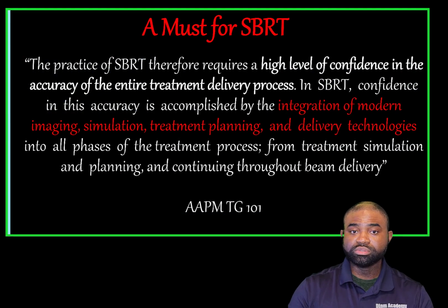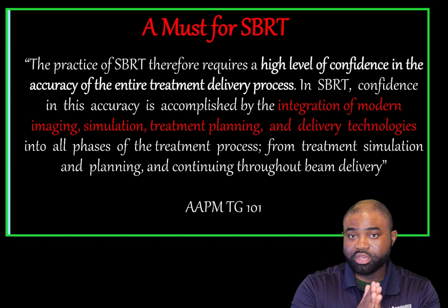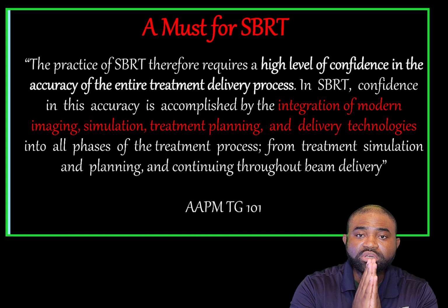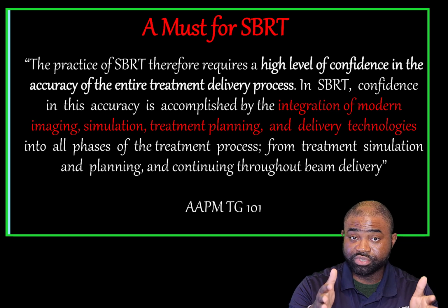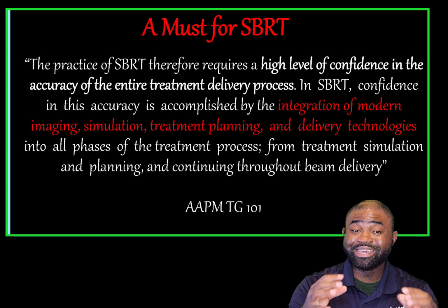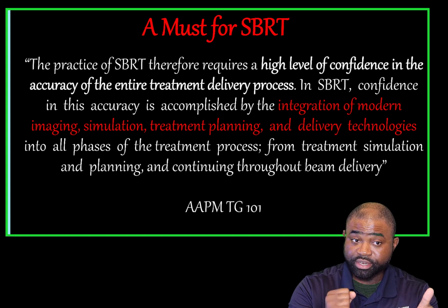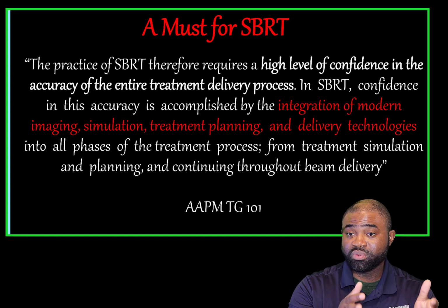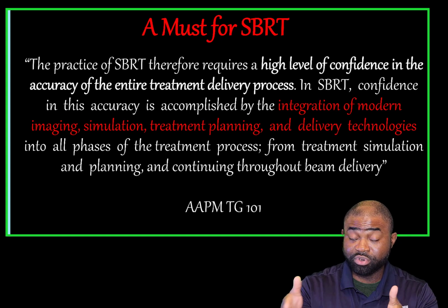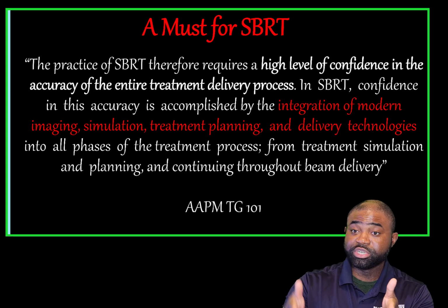And so to end this, AAPM TG101 says this: that for stereotactic radiosurgery, especially stereotactic body radiation therapy, the practice of SBRT requires a high level of confidence in the accuracy of the entire treatment delivery process, from CT simulation to treatment planning to treatment delivery.